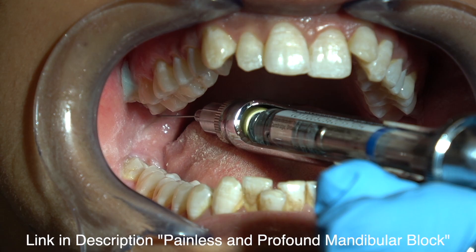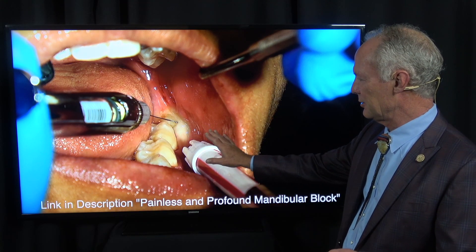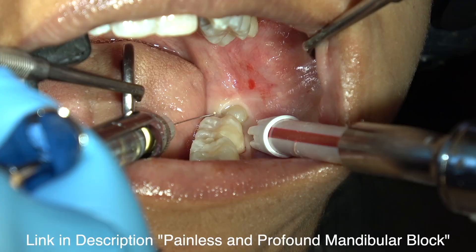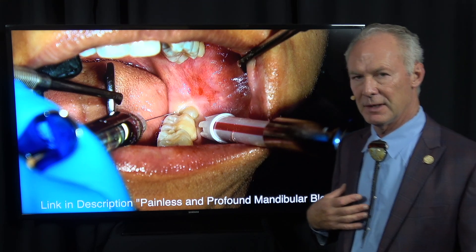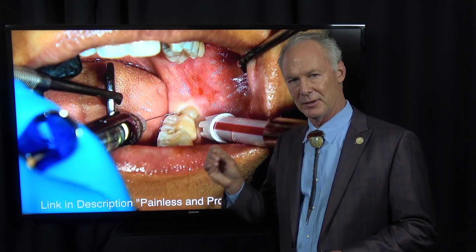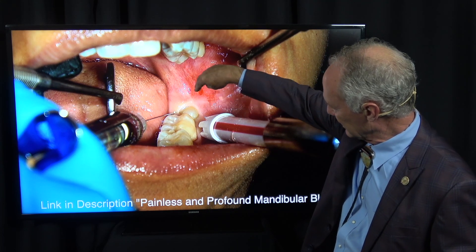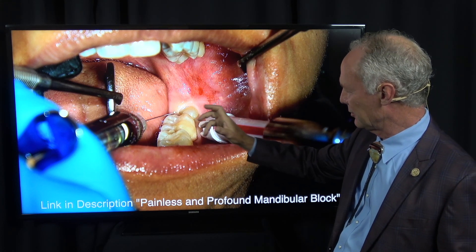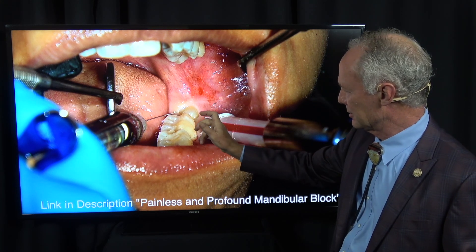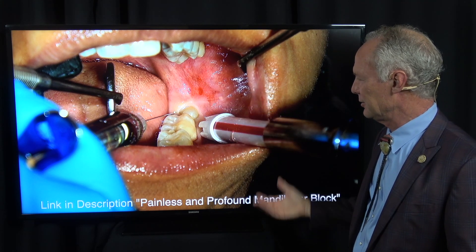I'm actually taking out all four teeth, but in this video we're going to show a method of removing the lower left impacted mandibular wisdom tooth. I always like to give an intraligamental injection. You want the bevel toward the tooth in the sulcus, and apply pressure both on the lingual and the facial for about 20 seconds — firm pressure so that the local anesthesia goes down into the periodontal ligament space, and you know that tooth is dead numb.